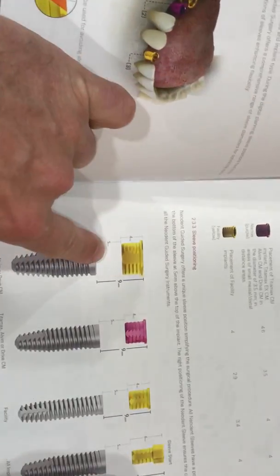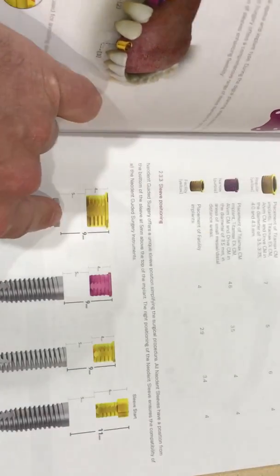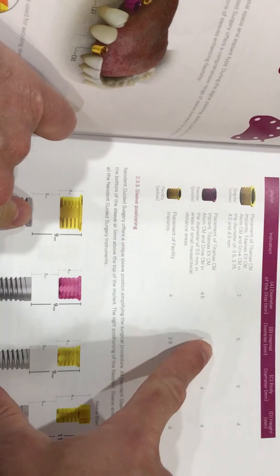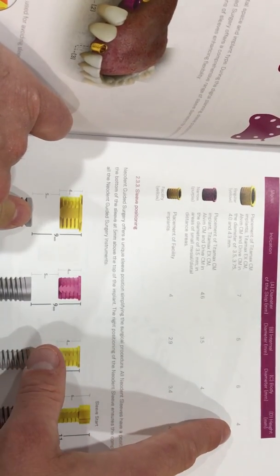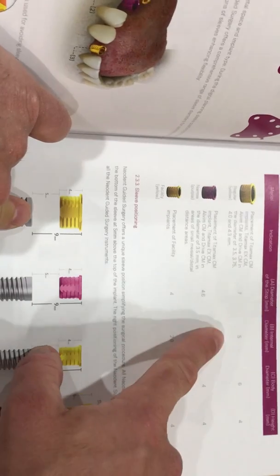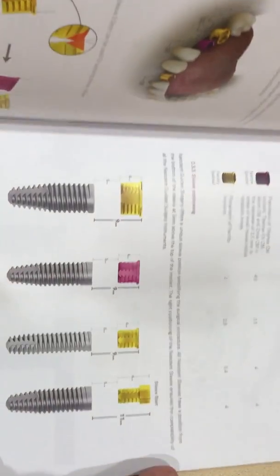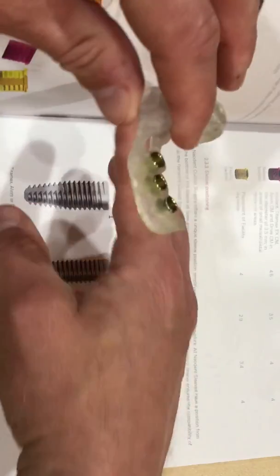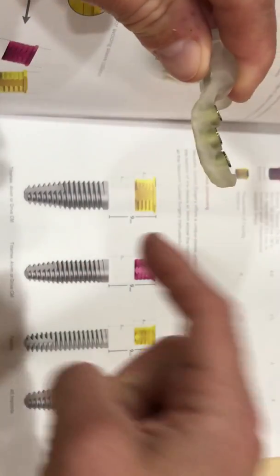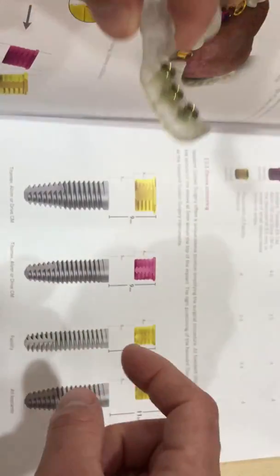Looking at our sleeves, they have a 4mm depth and an inner diameter of 5mm. They have a 1mm lip for the labs to know. Another important thing is the 9mm measurement — wherever the sleeve is in the guide, the top of the implant is 9mm below the top of the sleeve.